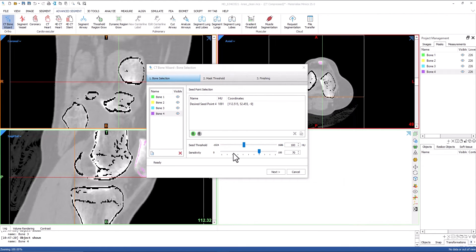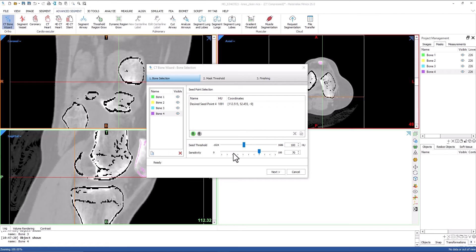Seed threshold and sensitivity can be used to assist the tool when separation is more challenging. The seed threshold will define the threshold for the seed points. The higher this value, the stronger the separation between the bones, since the seed values will typically be in the cortical bone range.